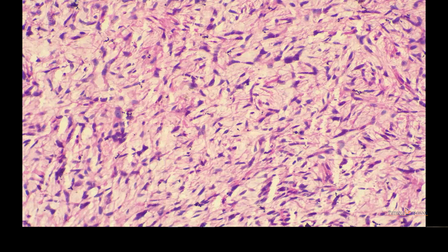In this slide, we can see spindle-shaped cells with elongated nuclei and scanty to moderate amount of eosinophilic cytoplasm, and some amount of pleomorphism. We can see pleomorphic nuclei, large hyperchromatic nuclei. Next slide.